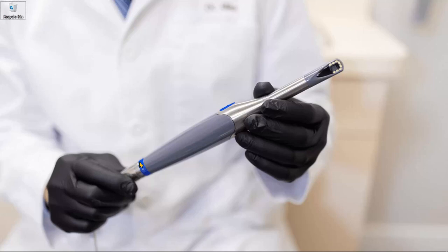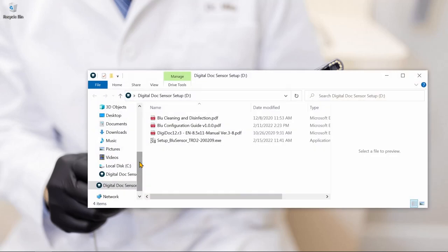Thank you for choosing DigitalDoc for your dental imaging needs. My name is James, and I'm here to help you out with the installation and integration of the Blu X-Ray Sensor.